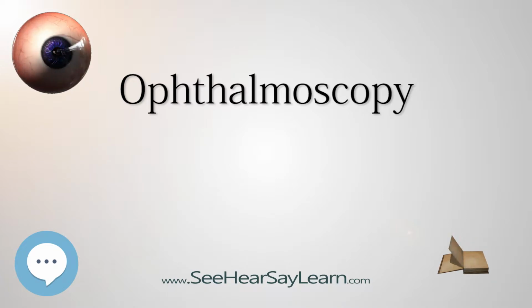Each type of ophthalmoscopy has a special type of ophthalmoscope. The direct ophthalmoscope is an instrument about the size of a small flashlight, torch, with several lenses that can magnify up to about 15 times. This type of ophthalmoscope is most commonly used during a routine physical examination.